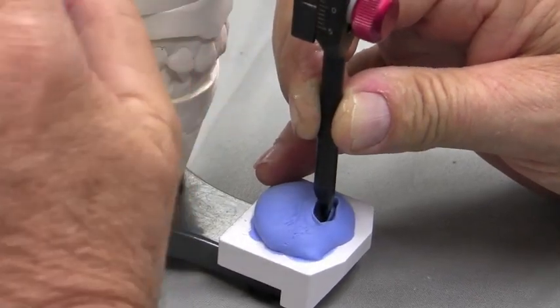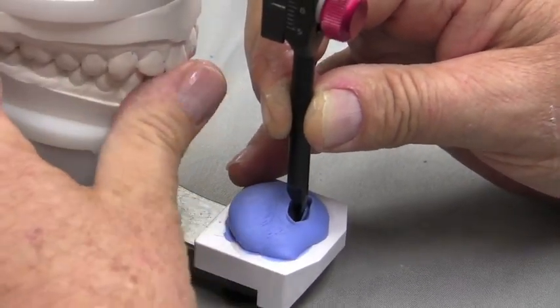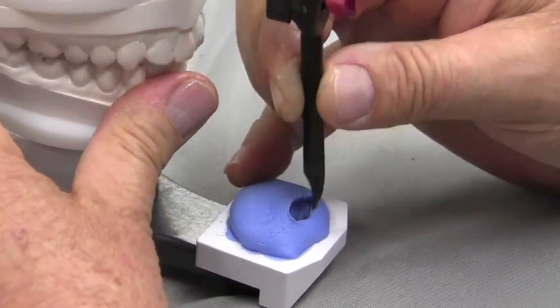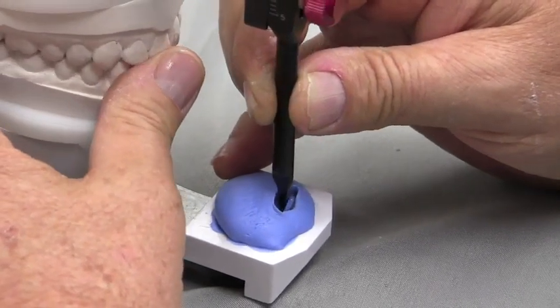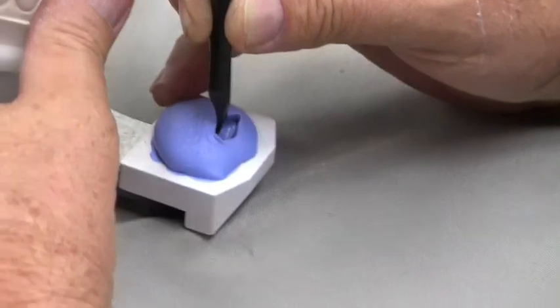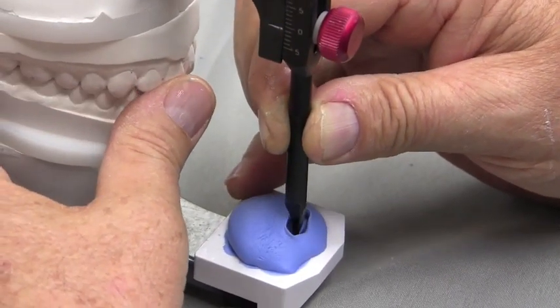And this is why I love this closed condyle kit — it doesn't allow my upper member to lift off those condyles; it keeps them in position. And I just kind of keep working this, open, close, back and forth. And it should be almost a diamond shape. I want to make sure that everything is smooth — I've got no ripples, no channels. It's really nice.